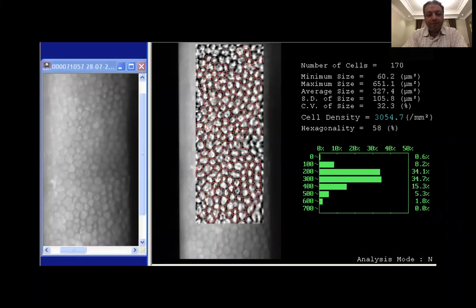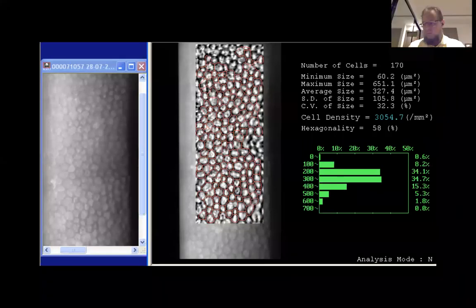Okay, so let me move to the point of if we are planning to go for lens-based surgery for this patient, for example, clear lens extraction with toric IOL. Of course, I don't do clear lens extraction for myopic people, but just in case, this is why I presented the specular microscopy, because this is one of the main investigations that we have to do before any intraocular surgery, even in cataract.